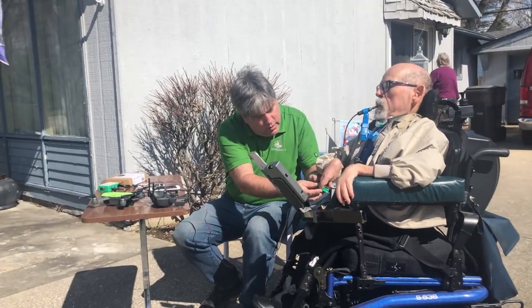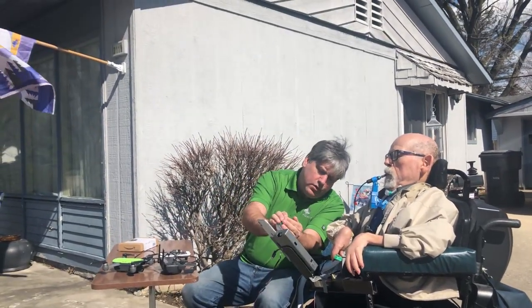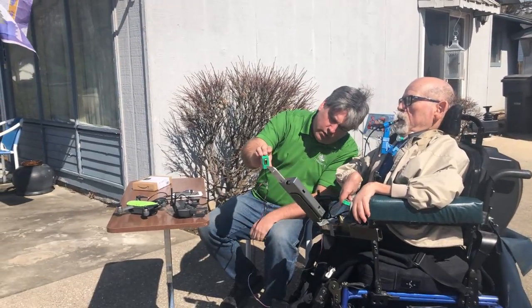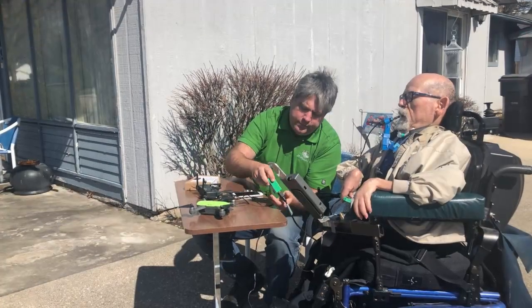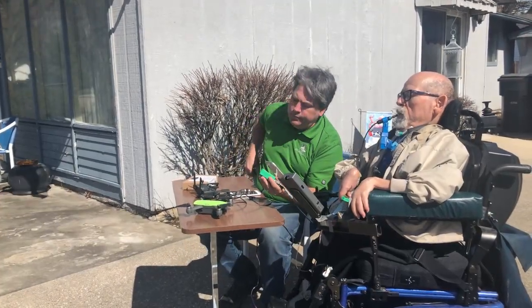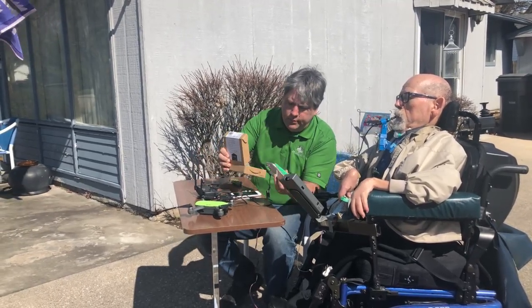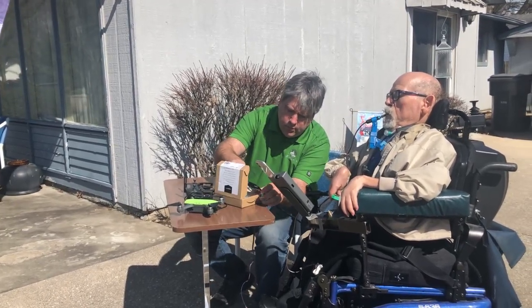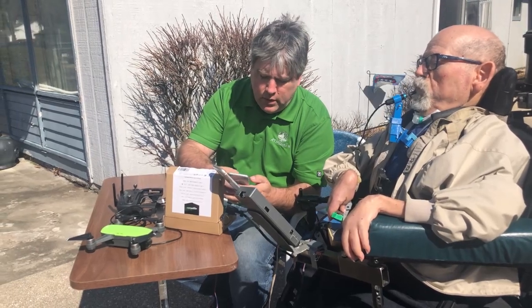Lori's getting used to the gimbal mount that's holding her iPhone — she gave up on that later and just held the iPhone by hand. Bill's checking that I'm hitting the right modes. The little LED indicator tells me what mode I'm in. We need to find a place to put that box where I can see it. We put it inside a little cardboard box to shield the sunlight from it, so that I could see the LED.